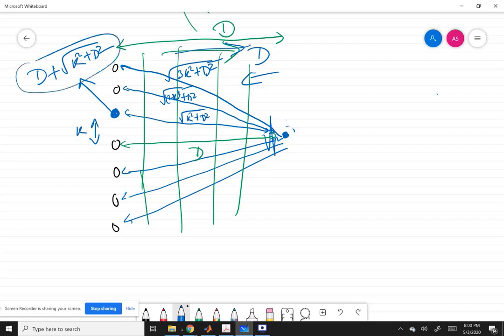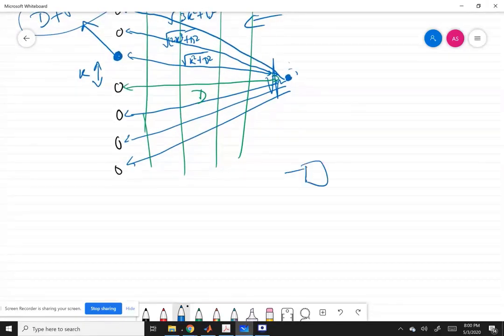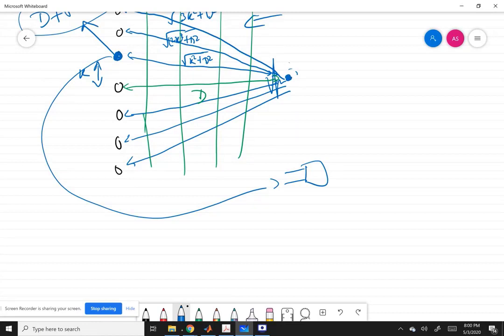So suppose this is that transducer. Once we fire the transducer, a wave starts traveling and hits the point of observation. It's a little difficult to explain, because in the forward path we assume that it's a plane wave which is traveling from the transducer face itself.